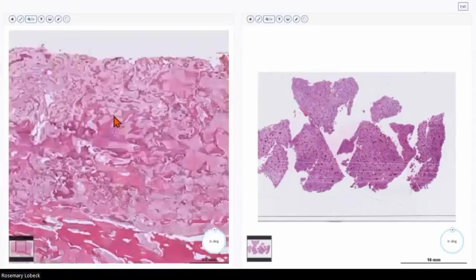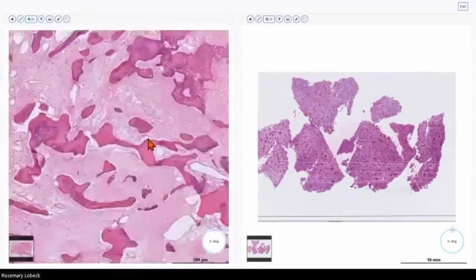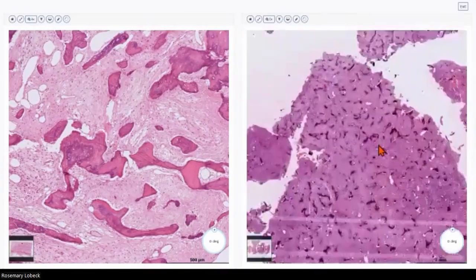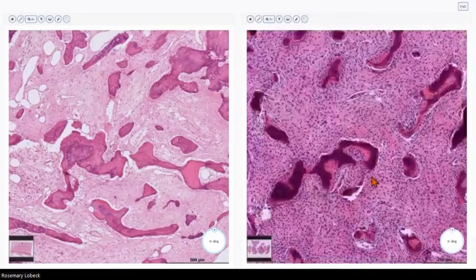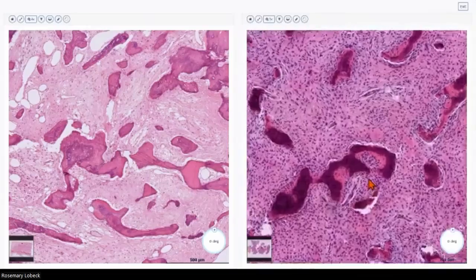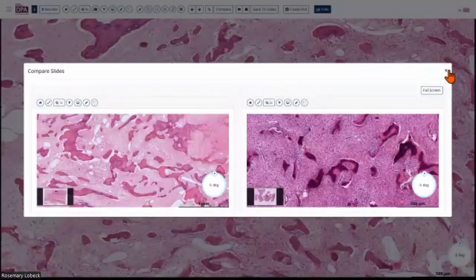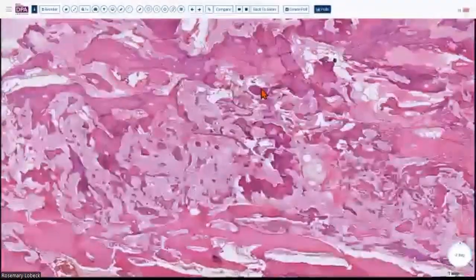So let's zoom in right here, somewhere around, right? And we'll stop here, and then anywhere in the fibrous dysplasia, you could just go in and just compare. So the bony trabeculae look very similar. In fact, the fibrous dysplasia looks more cellular and more hyperchromatic than our malignancy. So this is a huge pitfall, and one has to be aware of that. So let me exit out of here, and then I want to show you another feature that's also another big pitfall in cases like this.